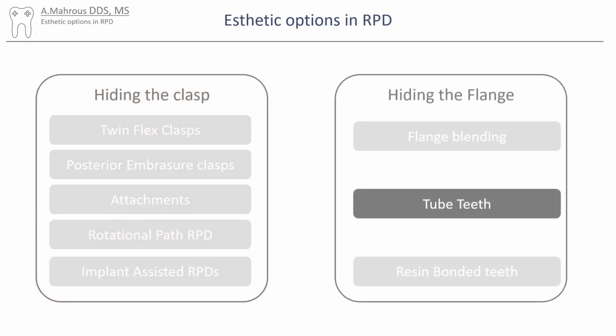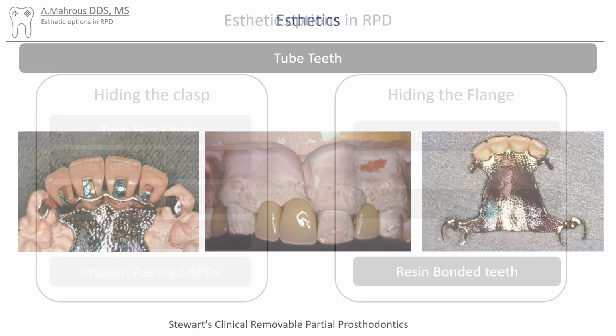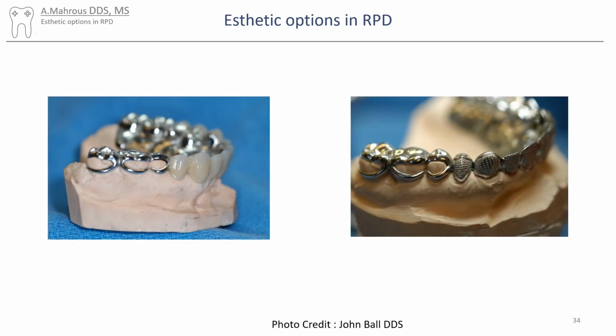Another option to hide the flange is not to have a flange at all, as with tube teeth. Tube teeth are cemented directly onto the framework with no pink acrylic resin surrounding them. This allows teeth to appear as if they're coming straight out of the gingiva, which has a very good aesthetic effect. However, to achieve this, the patients would need to have minimum bone loss, which is not usually the case with RPDs. A similar option that also allows for additional customization of the teeth is to use resin-bonded teeth.